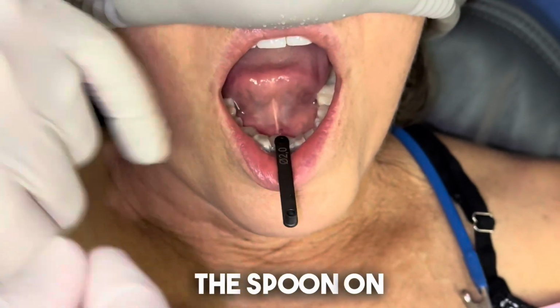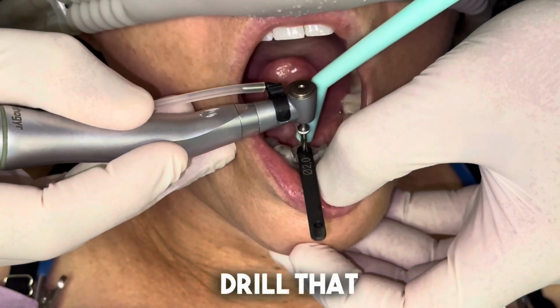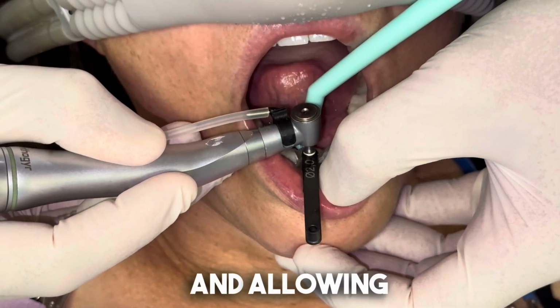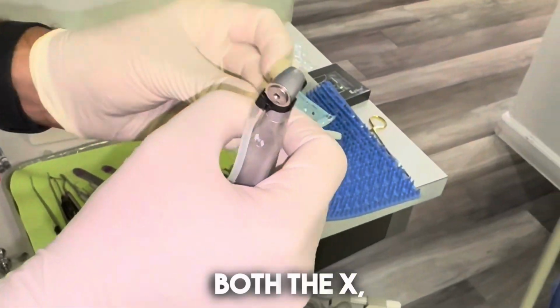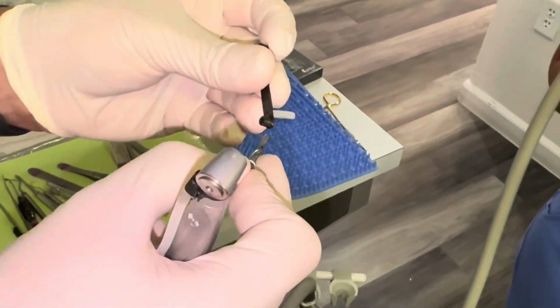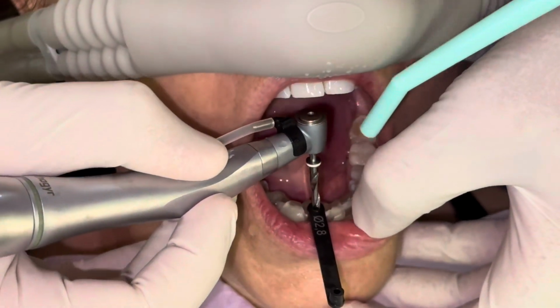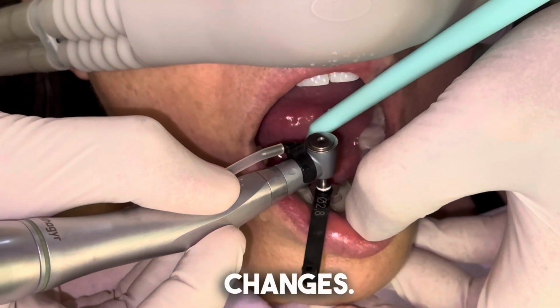Here comes the spoon on the right sleeve, and this is again the drill that goes in, up and down, and allowing the spoon to guide it in both the X, Y, and Z axis. Now we're going to the next drill, and it's a sequential expansion of the drill set. The spoon size also changes.